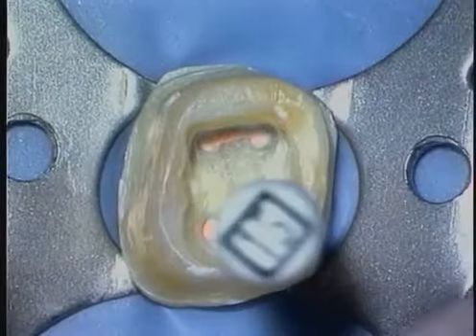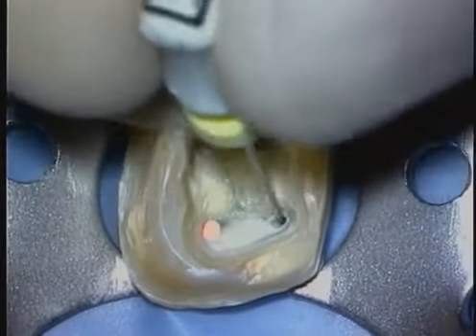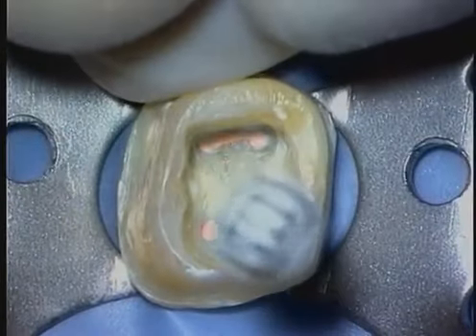Having faced off the orifices, instruments can be slid into these canals. If we have straight line access, the instrument is observed to stand up straight and tall. Sometimes we have to pick through little pockets of resistance so we can fully negotiate the canal.